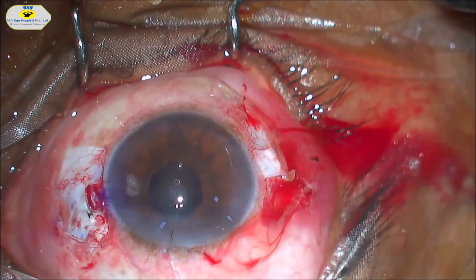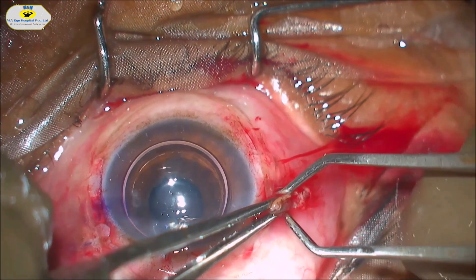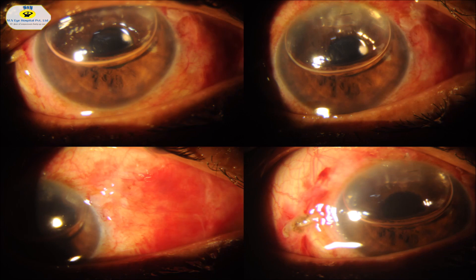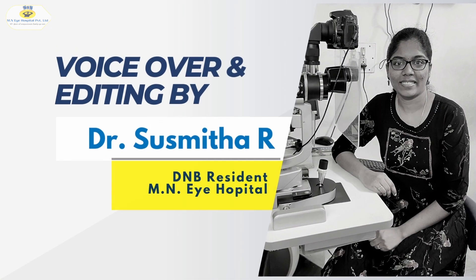The trocar is then removed. Conjunctiva is apposed over the scleral flaps and cauterized on either side. This is the immediate post-op picture of the patient where we can see a well-centred IOL.